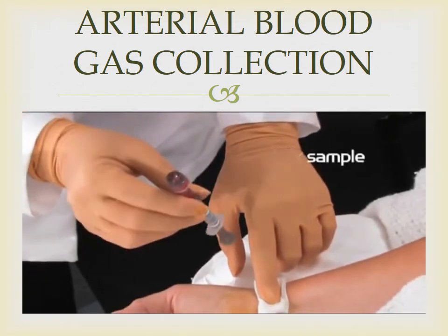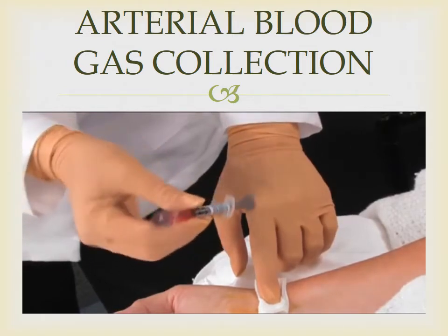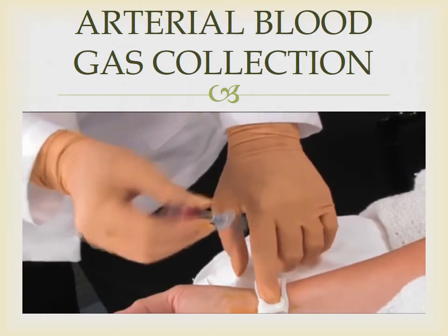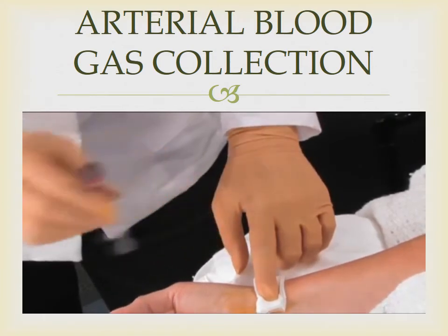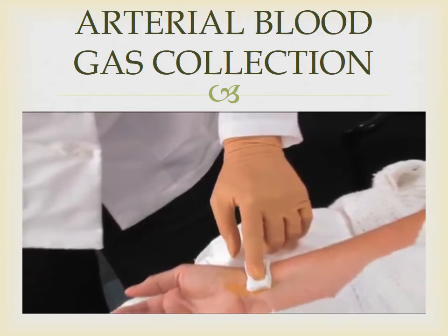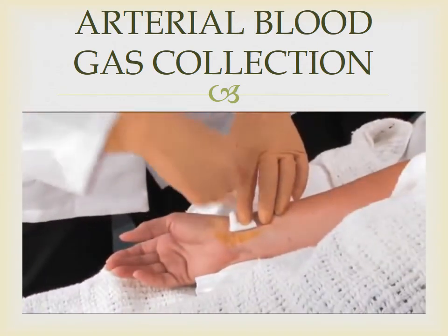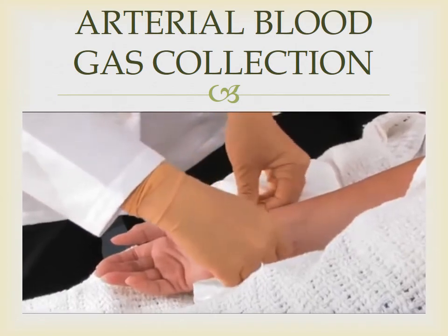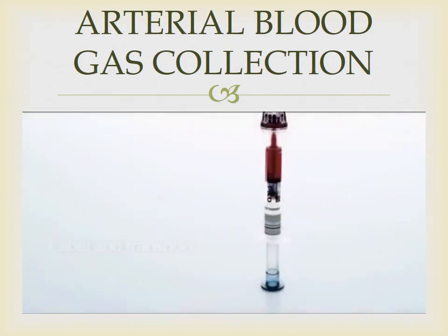The integrated mixing ball in the aspirator helps accelerate mixing with the electrolyte-balanced heparin and minimizes pre-analytical errors due to an incompletely mixed sample. An incompletely mixed sample can affect test results and patient treatment. Check the arterial draw site and apply a pressure bandage to the puncture site according to your hospital's protocol.